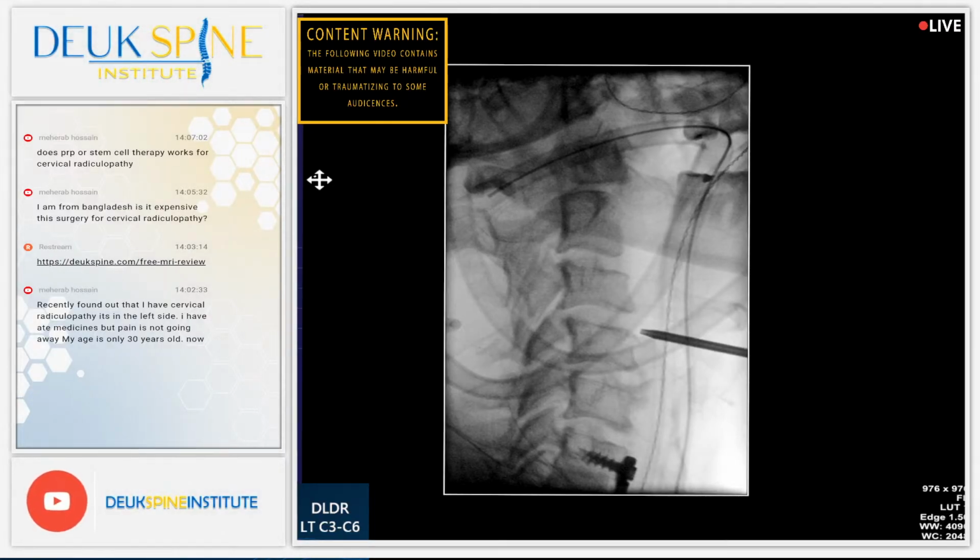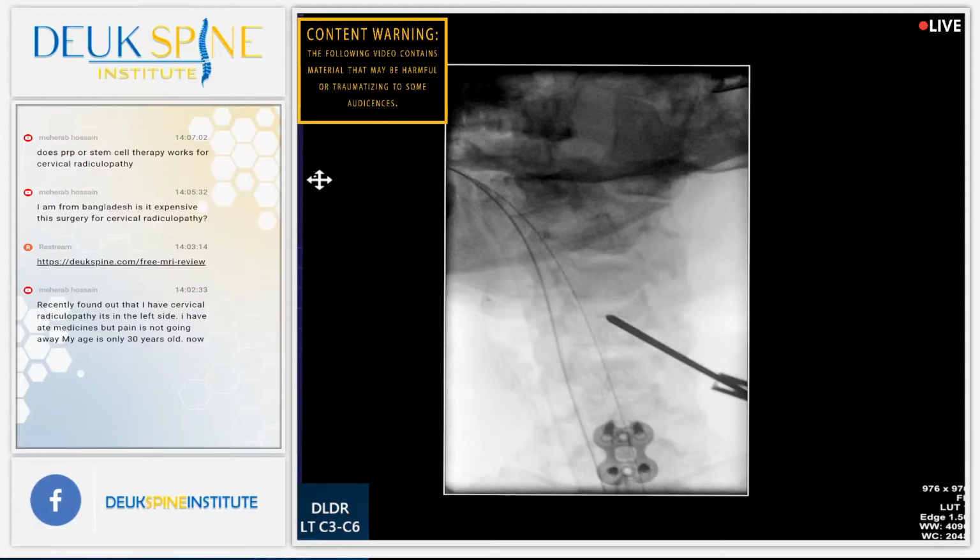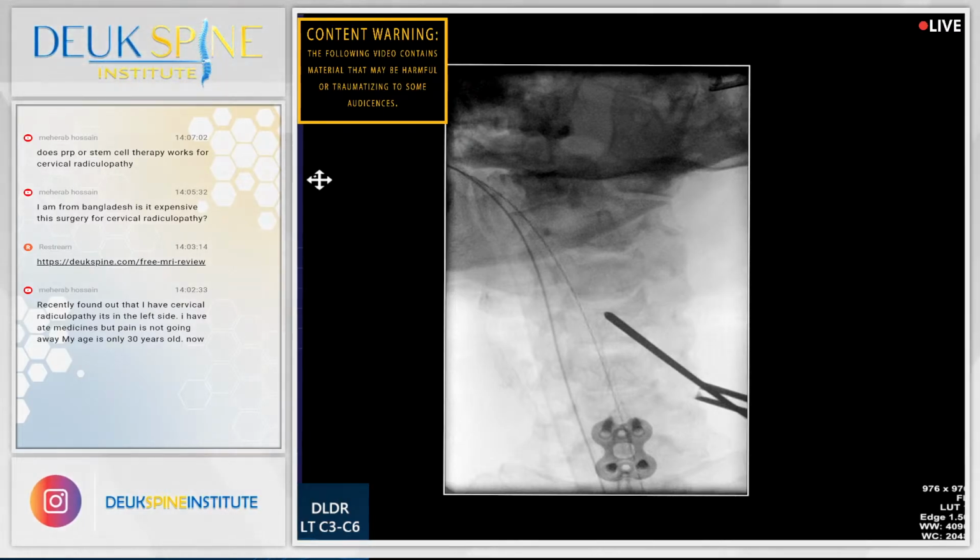Shot. All right, give me an AP view. I want that MRI up. I want to look at it one more time. Shot. Feel like I've gone too far to the left. Nope, that's perfect. Give me a true AP. Is that true AP? Shot? Yeah, it looks really good. Everybody agree? It looks good. It looks centered. That's amazing.